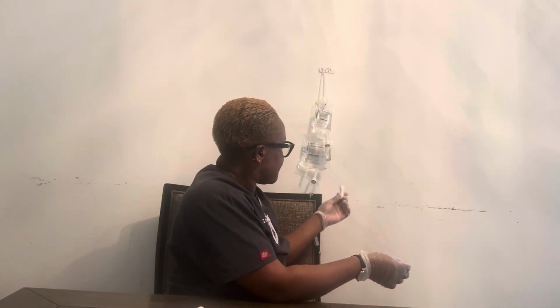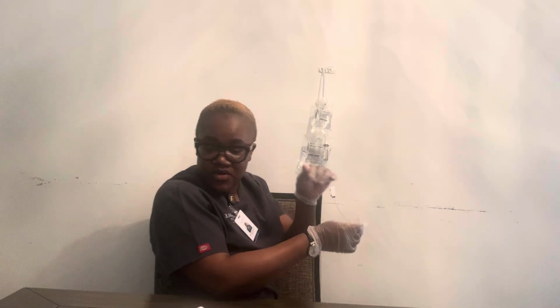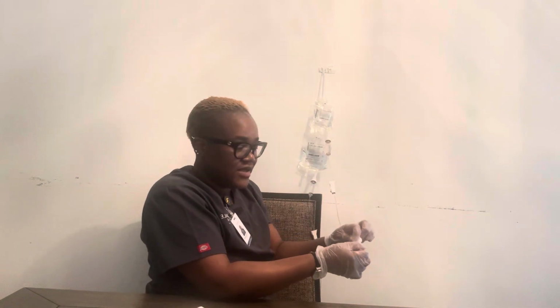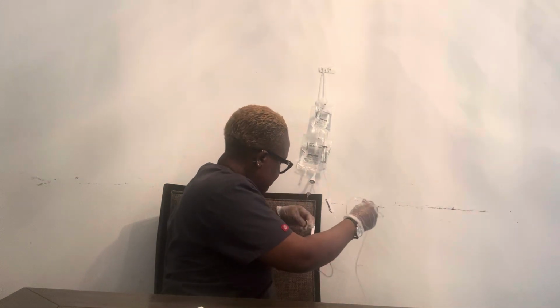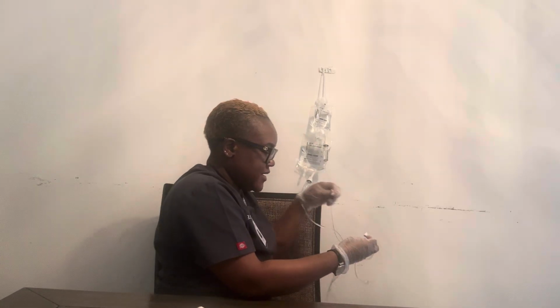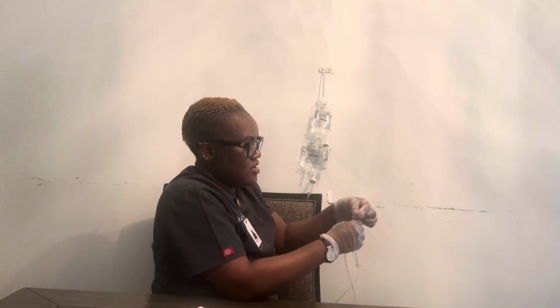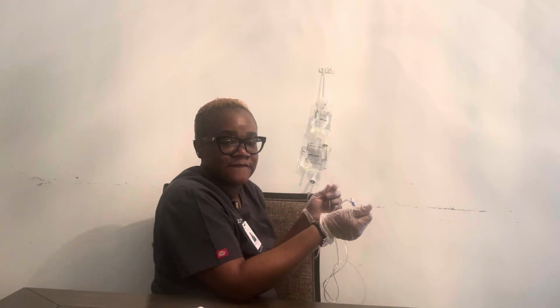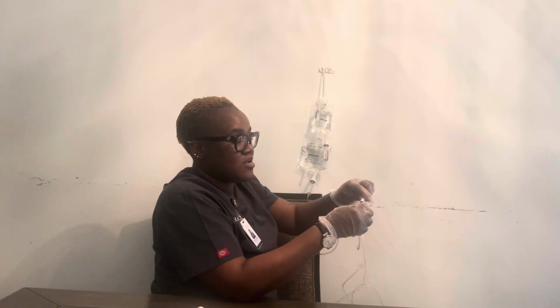Okay, so now that I've primed my line, I am gonna go ahead. I'm gonna use my alcohol pad, and then I'm gonna clean it. I'm gonna clean my white tubing. I'm gonna clean my Y area. And then I'm gonna wait until it's dry. And then once it's dry, I'm gonna remove the top, and then I'm gonna connect my medication.